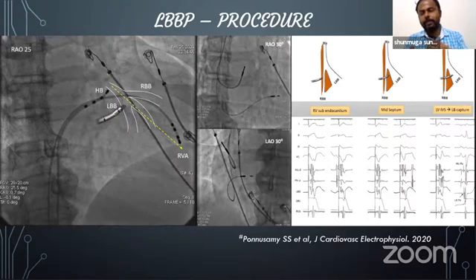So you have to give rapid turns so that the lead will go deep into the septum. While giving turns, after each turn, you can see the paced QRS morphology. What you can see here is, once it is on the right side, it shows a W pattern. And once the lead gradually goes in, you can see the notch of the W gradually ascends. Once the lead reaches the mid septum, the notch almost reaches the isoelectric line of the QRS segment. And once you give further turns, it almost forms an isoelectric line.